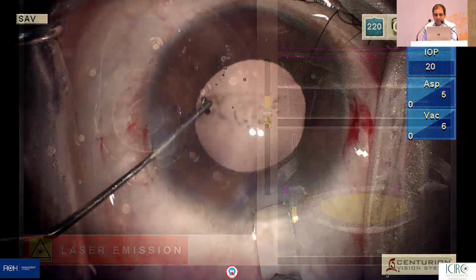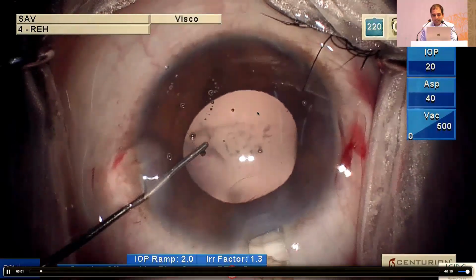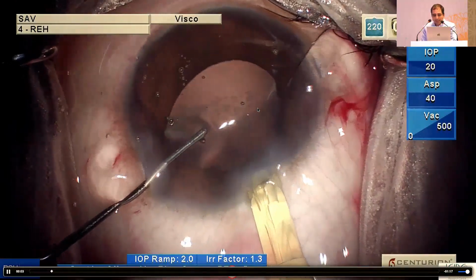And the surgery went off perfectly, and I followed what I learned from the previous case of not touching this plaque. I can always YAG it later. So now I'm going ahead and injecting this IOL, and I'm struggling a little bit.